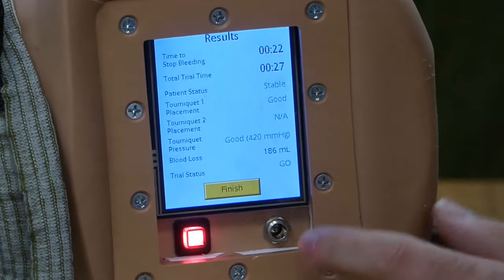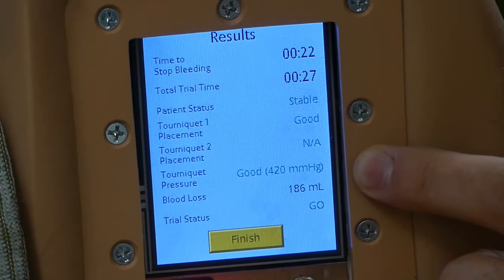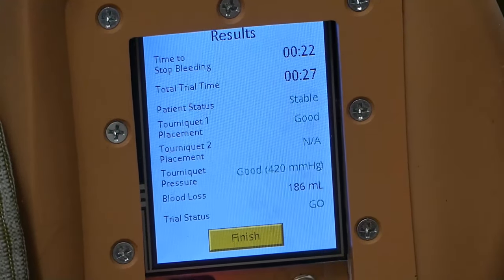So we're trying the SOFTT-W. We got 420 millimeters of mercury and 186 milliliters of blood loss. It definitely works.